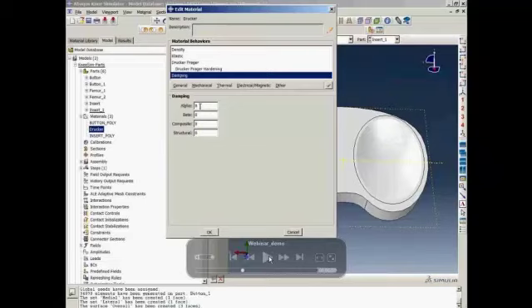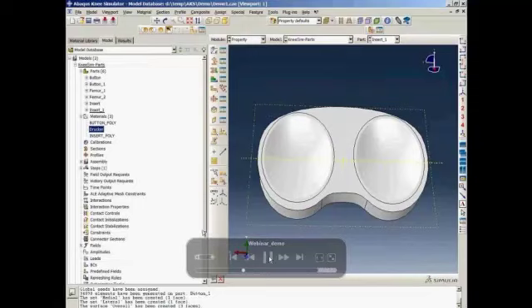Also, because the simulator uses Abaqus Explicit solver, we recommend the user to enter a damping, especially alpha damping, for each material they define. And what we found is that 100 alpha damping is a reasonable number to use for most polymer material. This is to remove any noises in the solution.